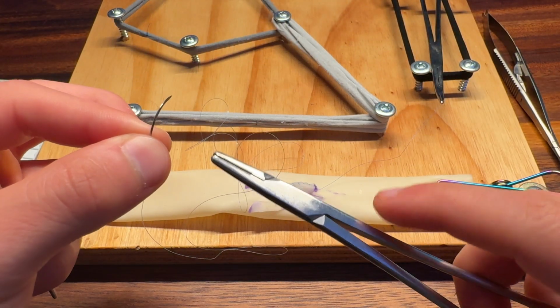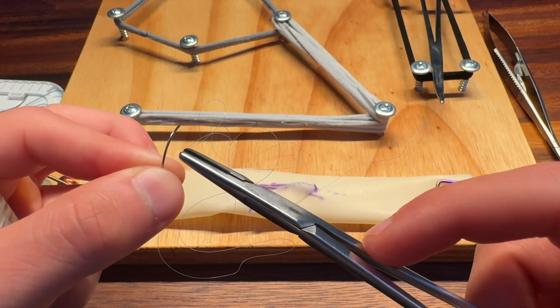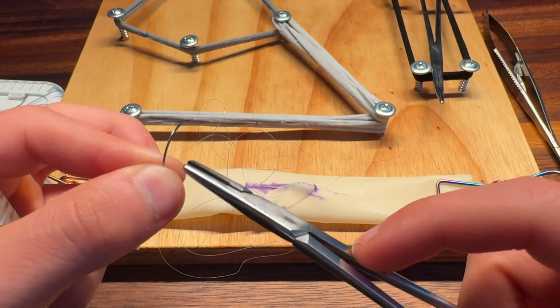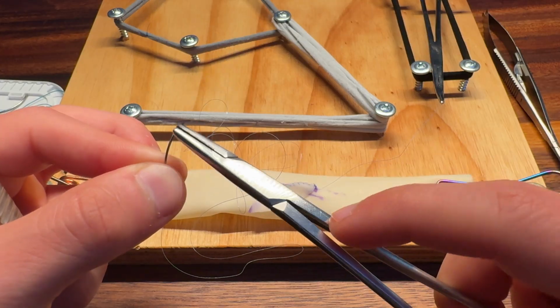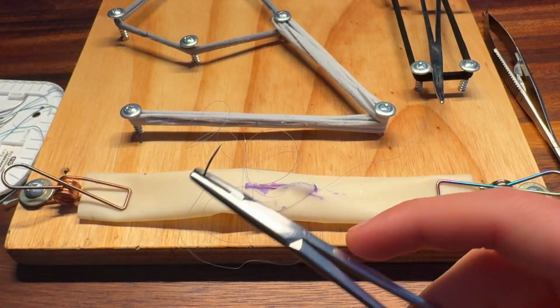Something that I failed to talk about in the beginning of the video is the fact that there are different types of sutures. You have your cutting and your non-cutting needles. And with the cutting, there are two categories. You've got the reverse cutting and then the regular cutting. So what does it mean by the cutting needle?